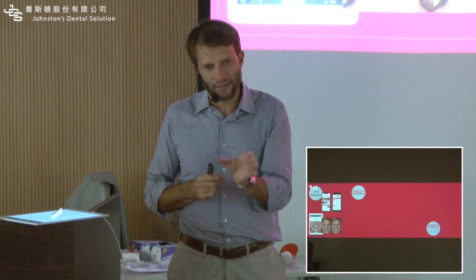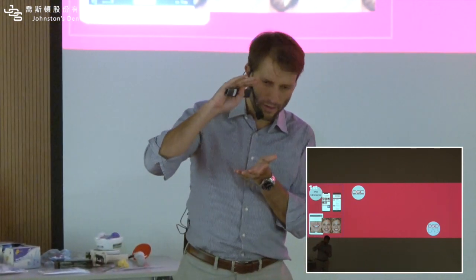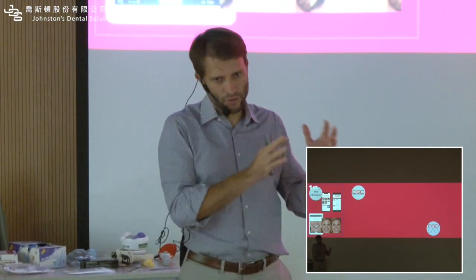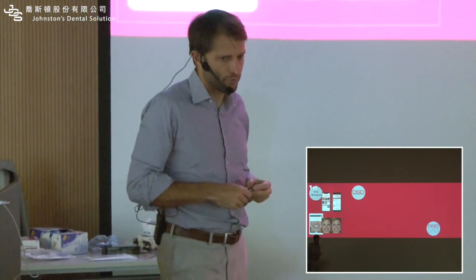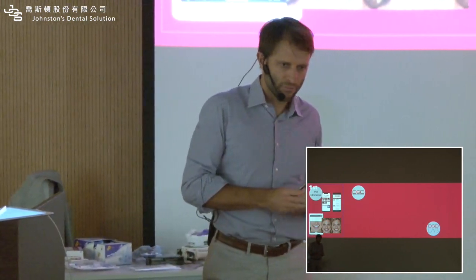So there's a chat inside the planning center website, every case has a chat between you and our team. So you can ask for changes and everything there until the design is approved. So usually in 2 or 3 days you get everything back to you.